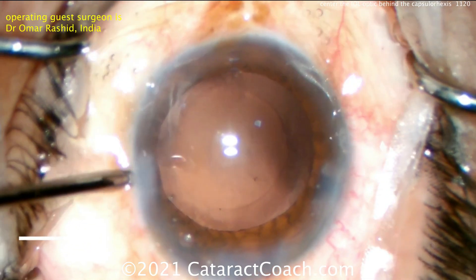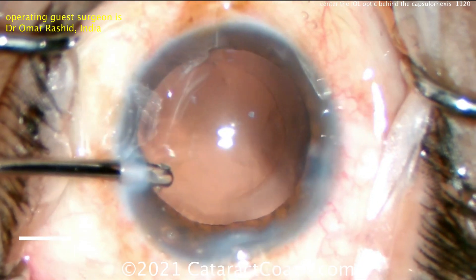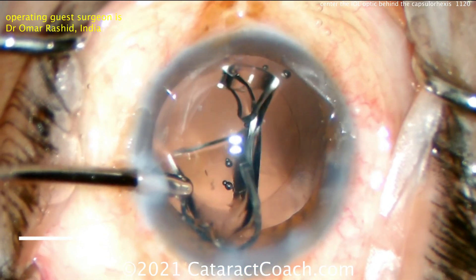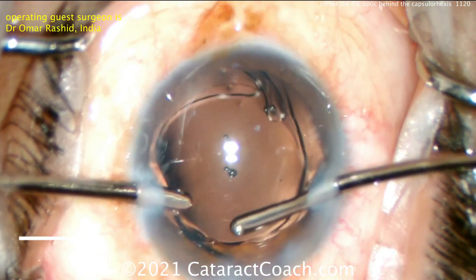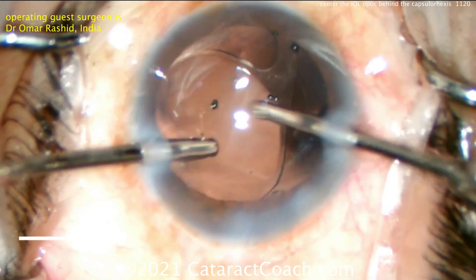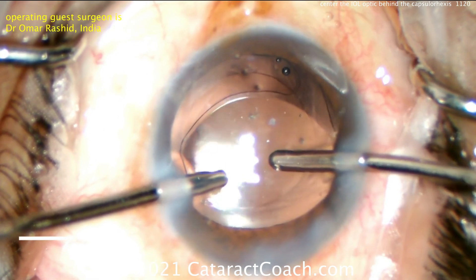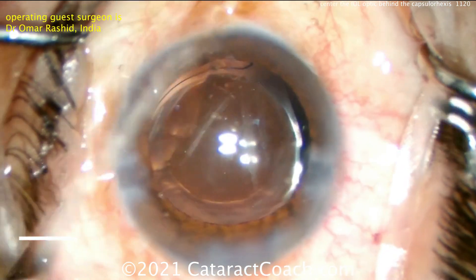Fast forward here — this is hydro implantation. The left hand is infusing the eye with balanced salt solution. There's no viscoelastic left in the eye, and here comes the lens implant — looks like a single-piece acrylic lens, going into the capsular bag. Let's see how he dials that in. Just using the aspirator from the right hand, getting that into the capsular bag. Very good — get that lens centered up. You want to really perfect your rhexis and keep it beautifully centered.